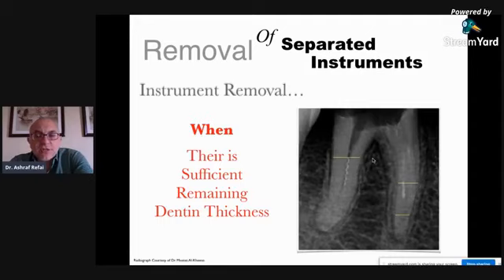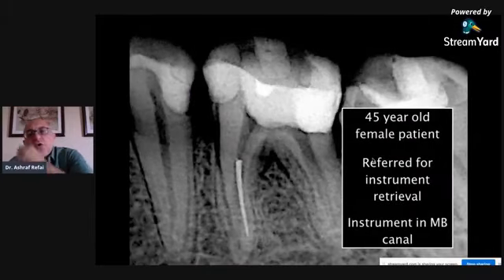I've seen some instances where dentists have applied the instrument removal technique directly over the fractured instrument segment, and this doesn't make any sense, because if you apply the instrument removal system on top of the instrument segment, there will be no way for the instrument to come out. So any application needs to be lateral to the instrument and not coronal to it. And you can see, depending on the level of the instrument fracture, the amount of remaining dentine thickness differs. Now, I'm going to show you a case here that I did maybe 2 months ago.